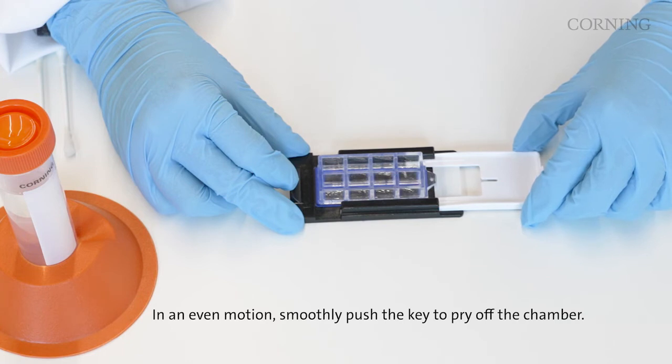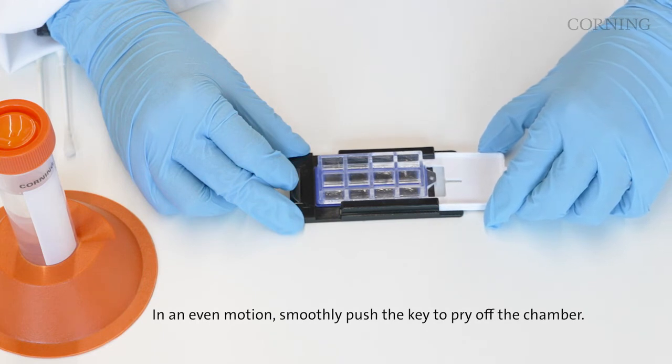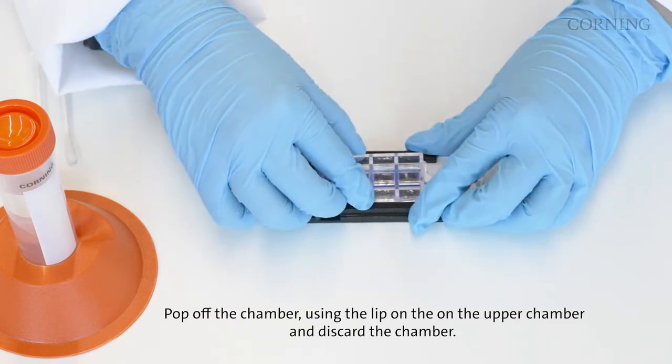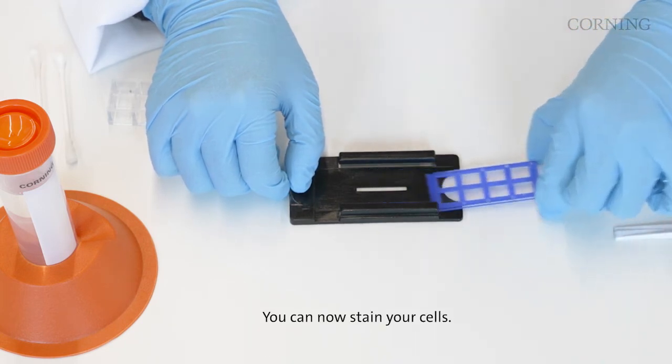In an even motion, smoothly push the key to pry off the chamber. Pop off the chamber using the lip on the upper chamber and discard the chamber. You can now stain your cells.